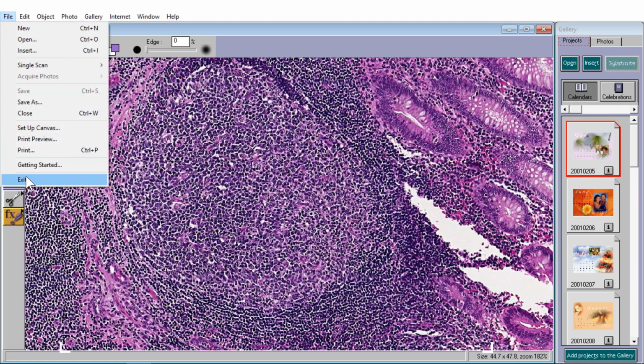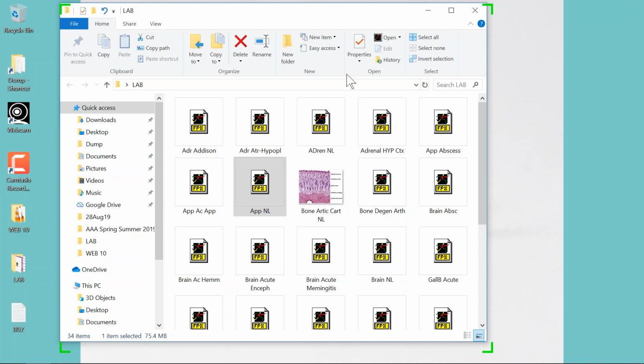Okay, I'm going to ask a question here because we've been cooking pretty good. I want to make sure I'm on the right track. The cases that I'm showing, do you think that they are simple enough, or let's say clear enough, for a person who is not a pathologist to understand? Remember, I'm assuming you're not a pathologist, but I am assuming that you do have some basic knowledge with histology and some basic understanding of these disease processes we've been talking about. And I got several yeses, so I'm very, very happy to hear that.